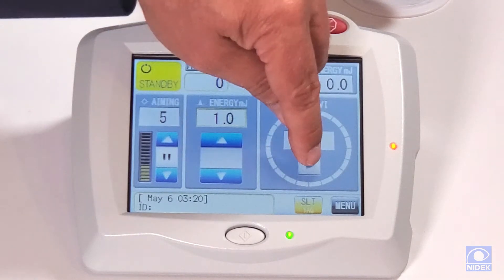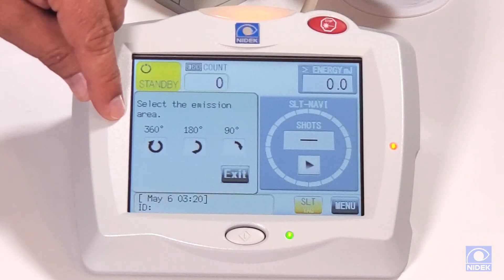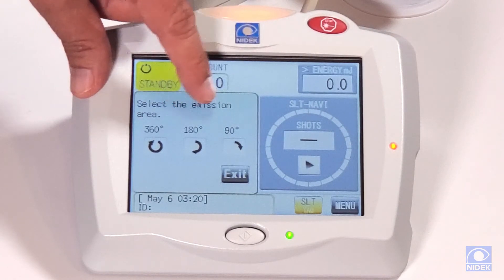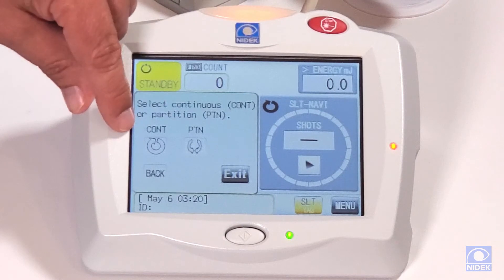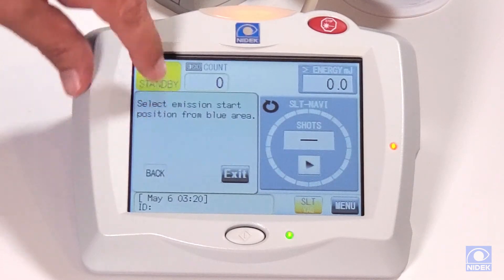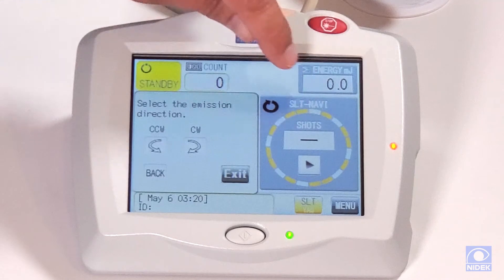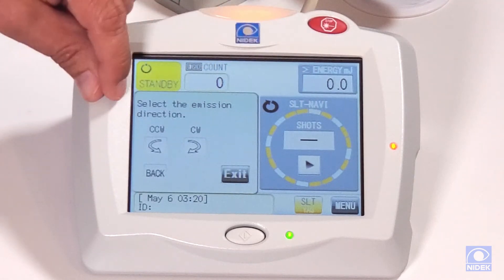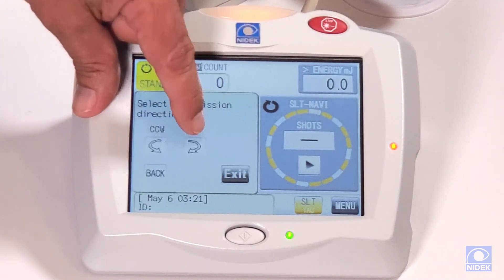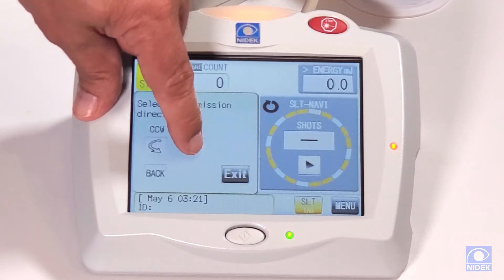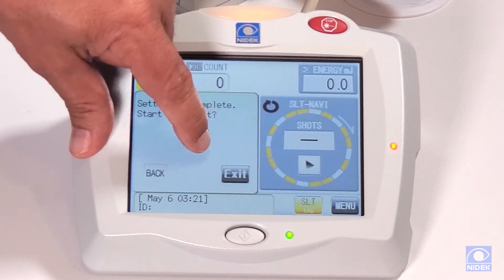To use it, we select our navigation setting: 360 degree treatment, 180 degree treatment, or 90 degree treatment — either continuous or partition. Then we select our area. For example, starting at 12 o'clock, we can go counterclockwise or clockwise. I'm going to select clockwise treatment and press OK.